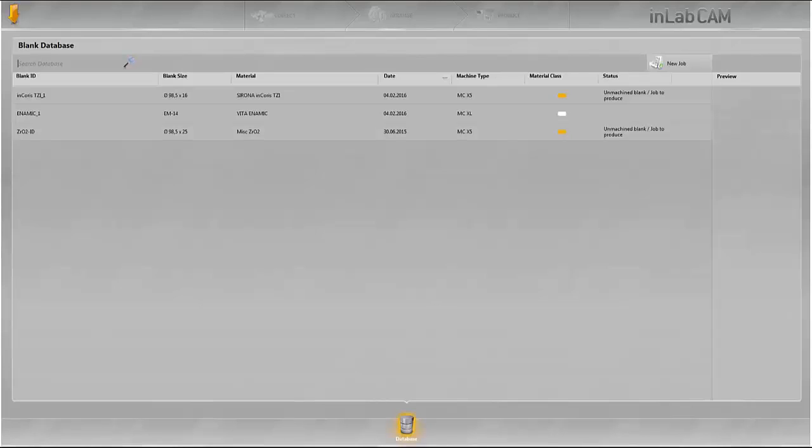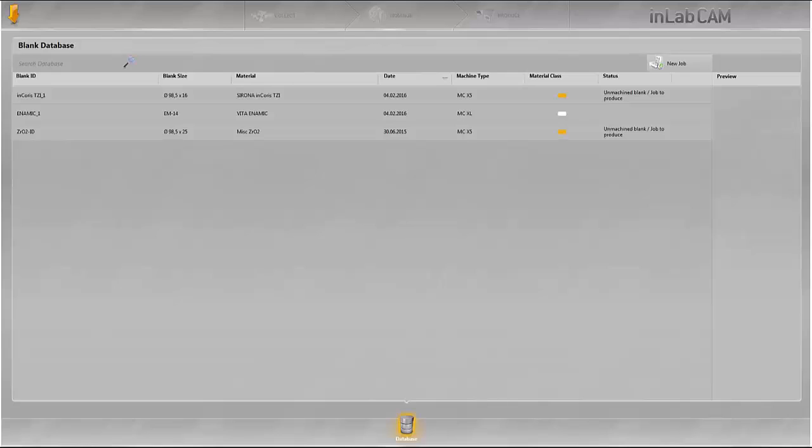Welcome to this tutorial on InLab CAM software 15. This video explains how to import design data from CAD software from another manufacturer in the STL format into InLab CAM software.